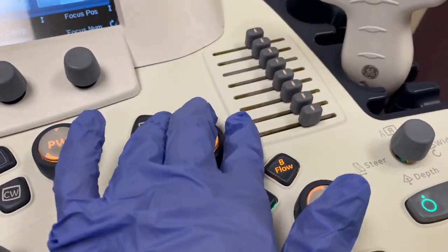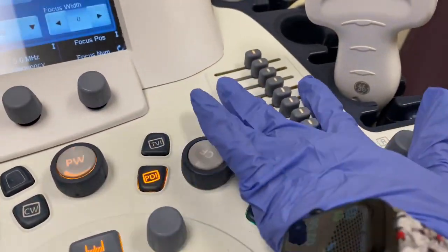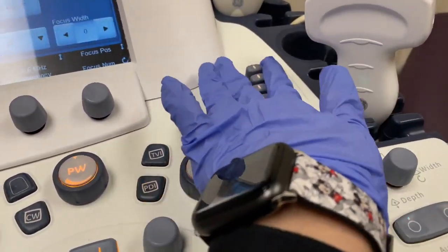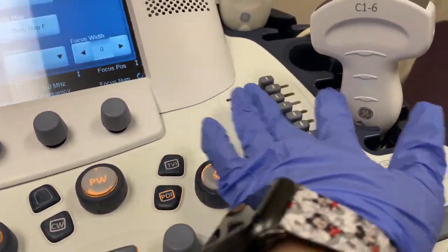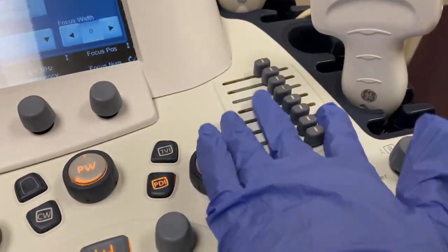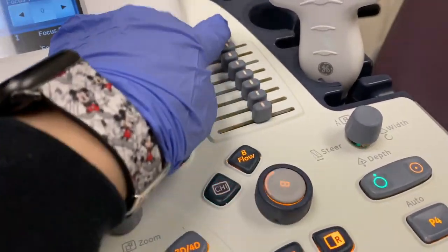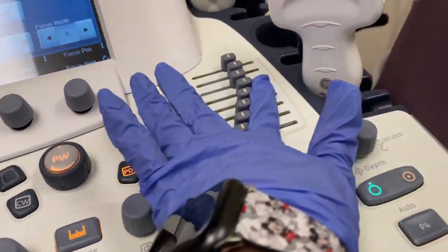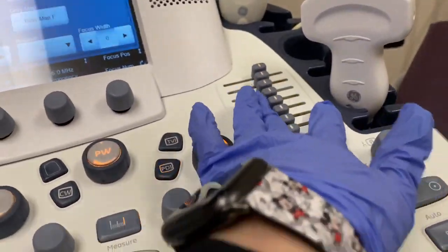We also use this time gain compensation, TGC, all the time. When you do this on your machine, you can tell, going to the right makes it brighter, going to the left makes it darker. It's kind of like cleaning up the echoes, cleaning up artifacts. You use this to clean your images and make it better quality. So we definitely use this every single day. See, we can move it around, back and forth.